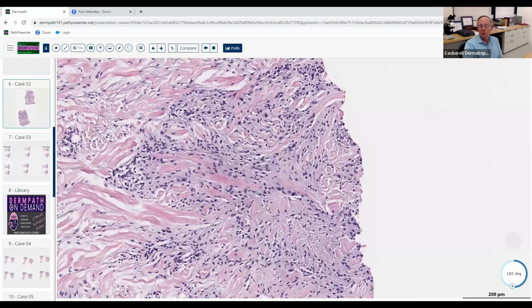What about a rheumatoid nodule? You said it a second ago. Oh, fibrin. Fibrin, good. And what about an NLD? Collagen. Yes, degenerated collagen. Good. So those are the three things. Now, when we say palisade, you guys know what a palisade actually is?